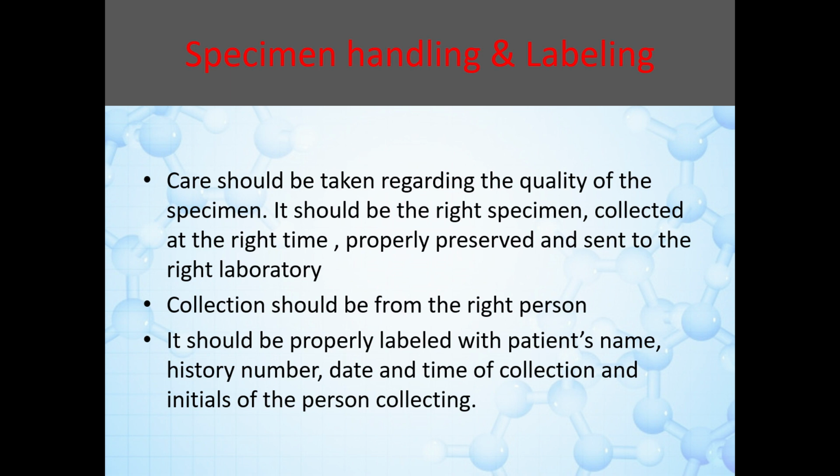And it's collected at the right time. Like if it's required that your patient fasts for 8 to 12 hours, you need to collect the blood after the patient has fasted, not before that. And it should be properly preserved and sent to the right lab. And collection should be from the right person. It's also important, because if you mistakenly collected from the wrong person, you'll get the wrong results.